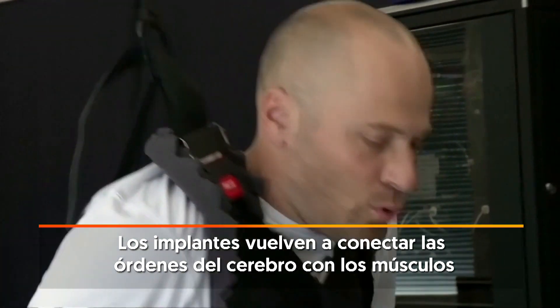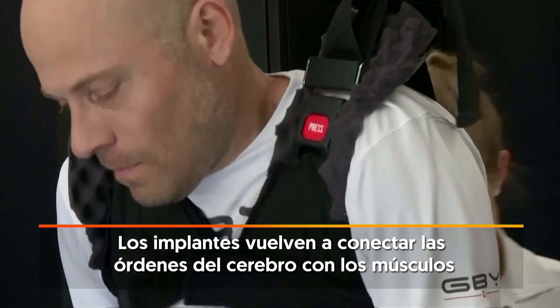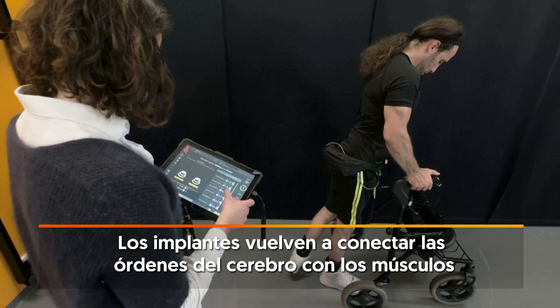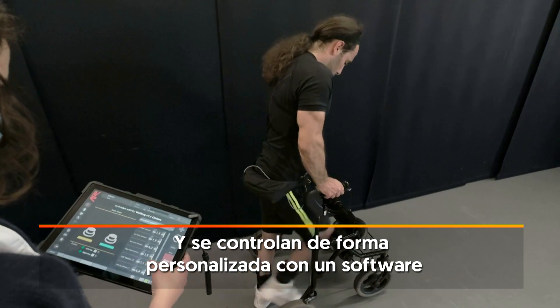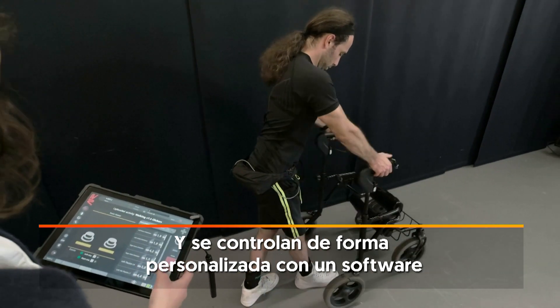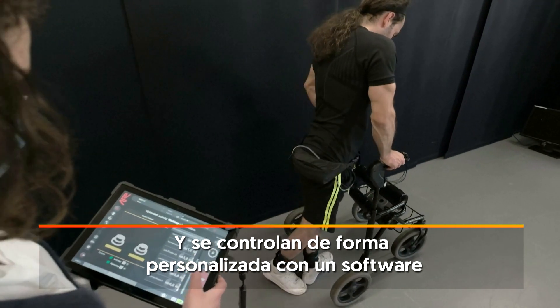It will need more forward force. Turn in the other direction. Left. Right. Left. Right.